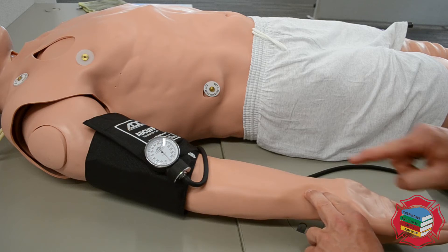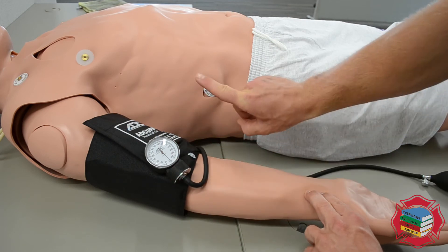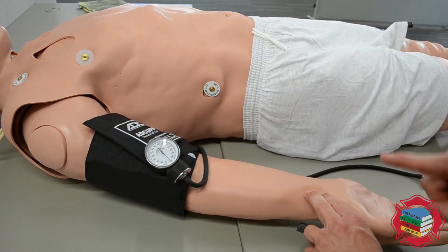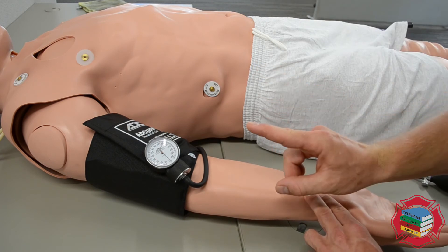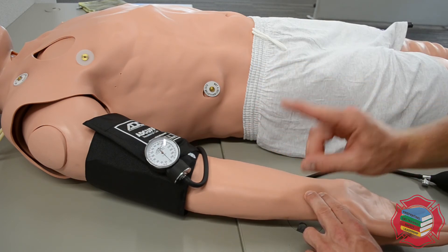As you deflate, make sure you are looking at the dial the entire time. Don't get distracted and look at other things, and don't look at the pulse site — the dial is what you're watching the entire time. The moment you feel the pulse return, document the number that the needle was at. Do not use the needle bouncing as a reliable test for the patient's blood pressure — that is inaccurate.